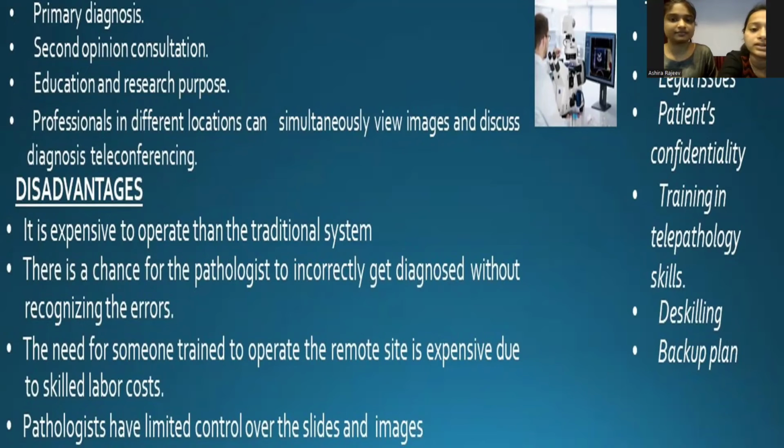This technique faces great challenges like quality issues, legal issues, patient's confidentiality, de-skilling, and backup plans. Quality issues include standards like image resolution, color depth that should be captured, speed with which image should be transferred, necessary qualities of any viewing station to ensure that the captured image is not degraded.